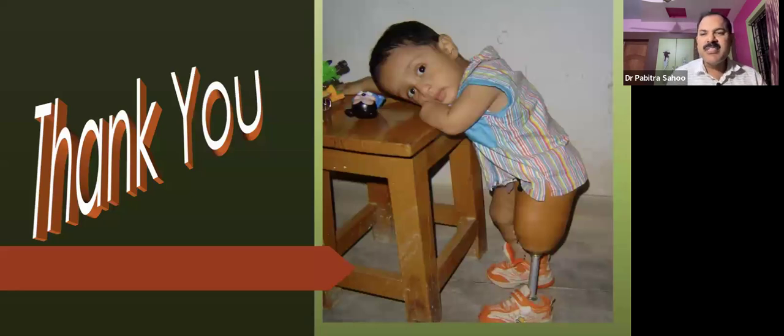And this is a small child fitted in our institute maybe a long time back with an AK prosthesis. In a small child, we don't give any knee joint, just as in orthosis prescription for a small child the joints are not provided. In this case also the prosthesis is fitted without a knee joint. As the child grows, he becomes aware of the different gait, I mean how a normal person walks. At that time a knee joint can be fitted.